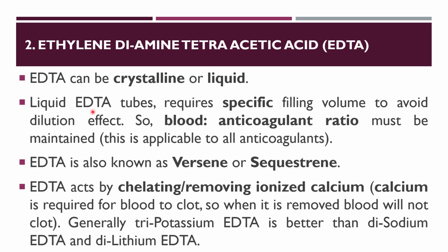So, what is the meaning of dilution effect? Sometimes it may happen that you have added more EDTA, and due to this you may get fluctuating results in whatever test you perform on the blood. So the blood to anticoagulant ratio must be maintained and kept in balance. This is applicable to all the anticoagulants which we will talk about in this lecture.